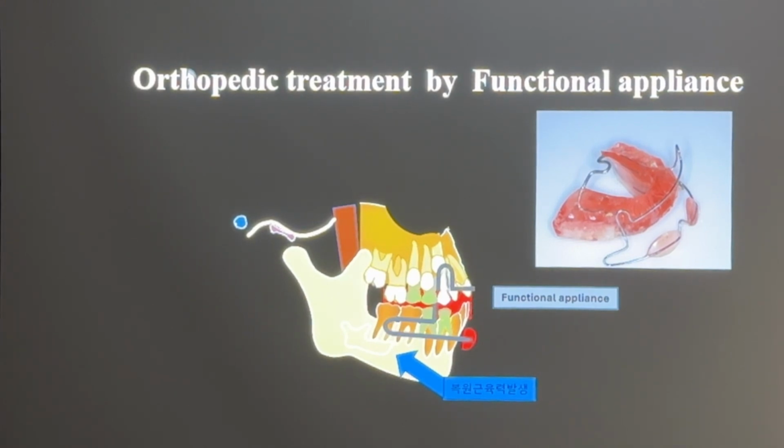Or if you want a straight down eruption, at that time cut straight down. So until now you understand the upper selective grinding, and the next step is lower selective grinding.